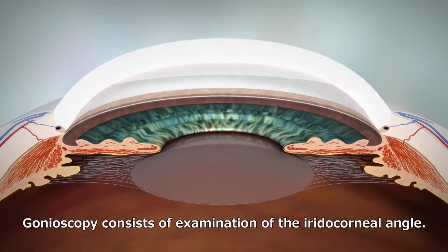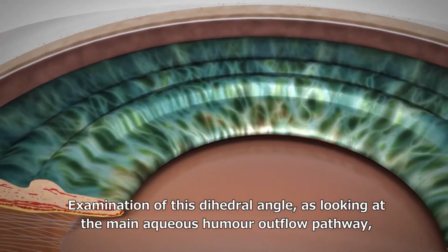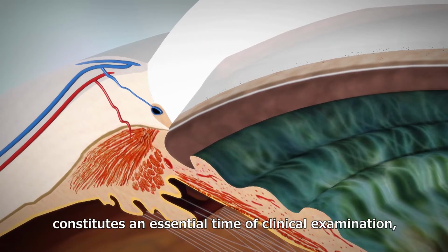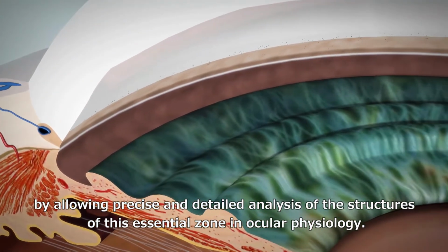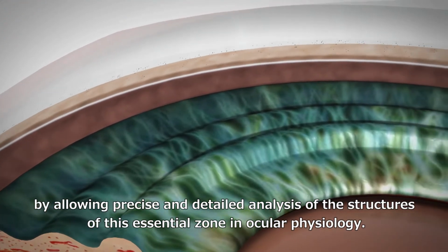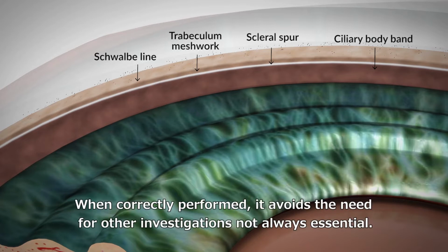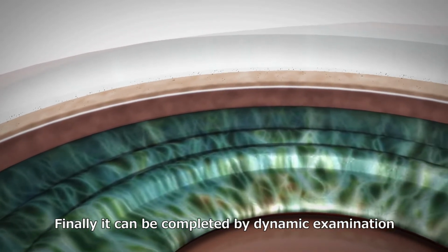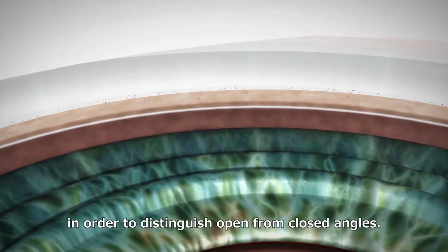Gonioscopy consists of examination of the iridocorneal angle. Examination of this dihedral angle, where the main aqueous humor outflow pathway is located, constitutes an essential time of clinical examination by allowing precise and detailed analysis of the structures of this essential zone in ocular physiology. When correctly performed, it avoids the need for other investigations, not always essential. Finally, it can be completed by dynamic examination in order to distinguish open from closed angles.